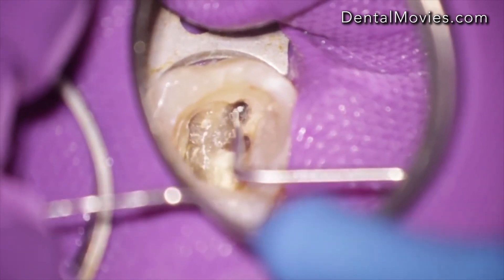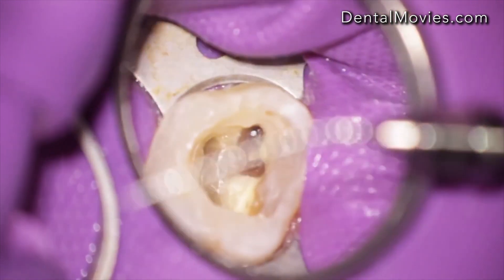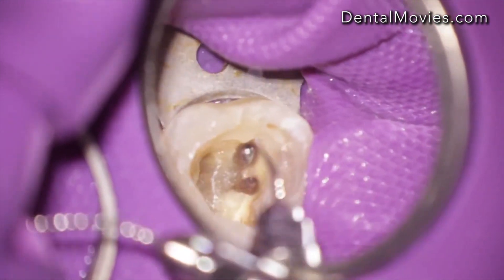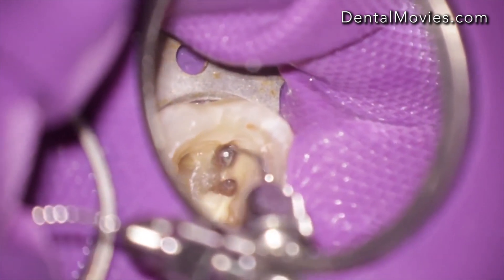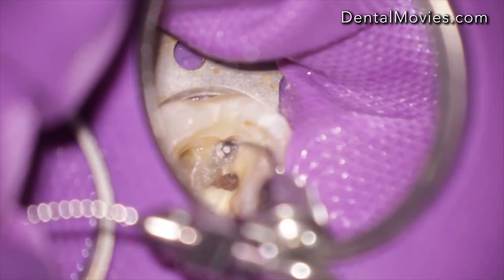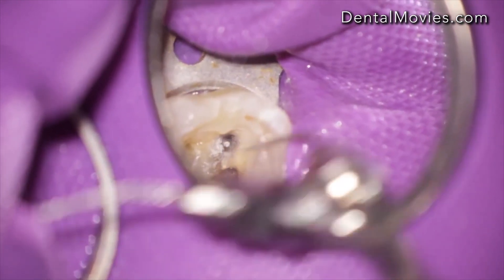So we decided to try another technique. In order to do this, we have to remove a little more of sound dentine with the endosonor file.